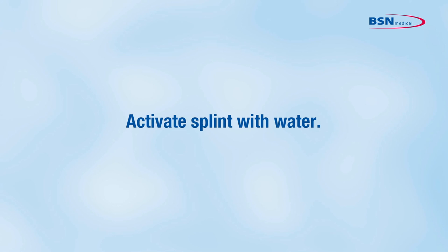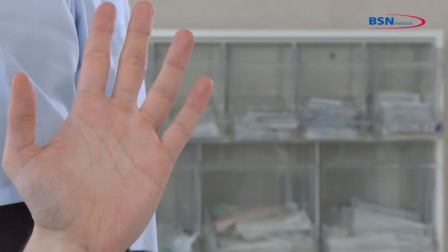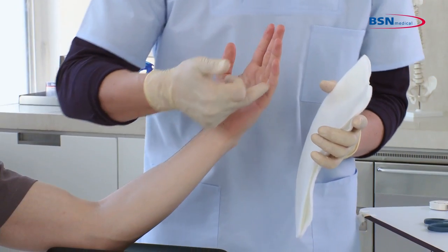Activate the splint with water. Put a padding stripe between the fingers to prevent skin irritation. Apply the splint to the ulnar side of the hand.